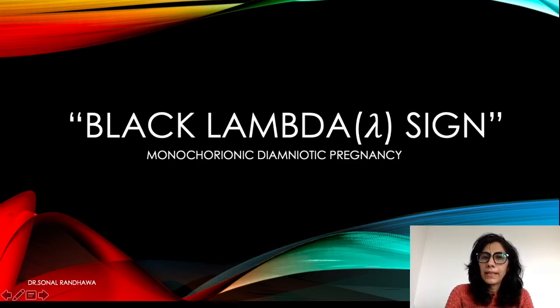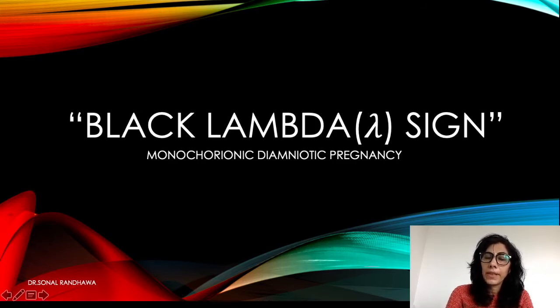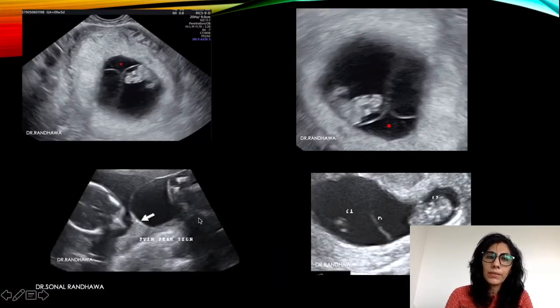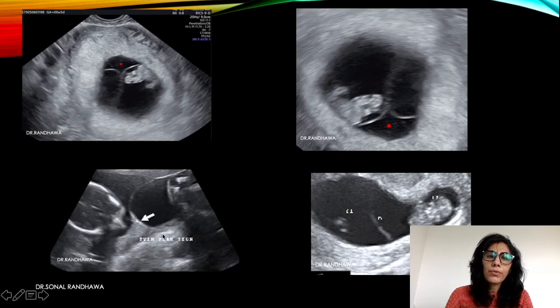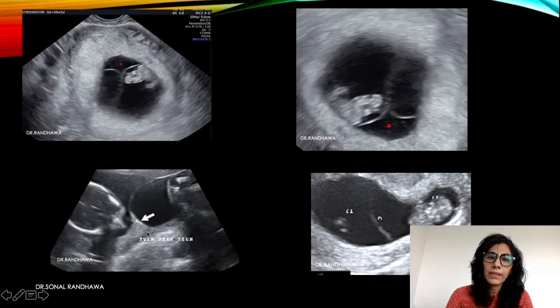But what is this black lambda sign? It is seen in monochorionic diamniotic pregnancy. First, let us talk about the normal twin peak sign or lambda sign, which we all know is seen in dichorionic diamniotic pregnancies. You can see a protrusion — a peak-like or triangular area attached to the separating membrane — called the twin peak sign or lambda sign.